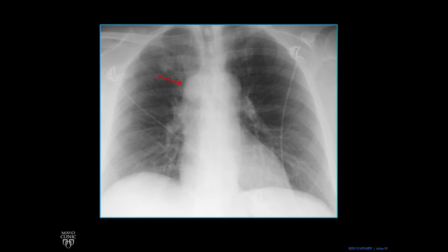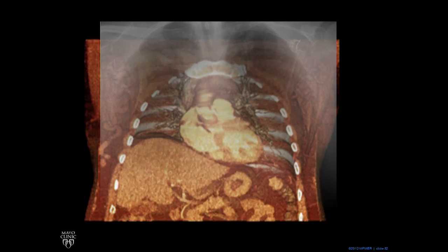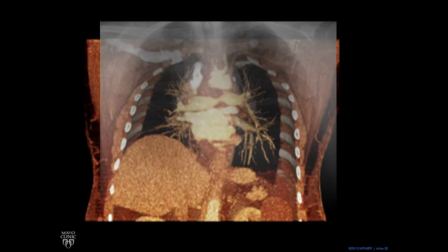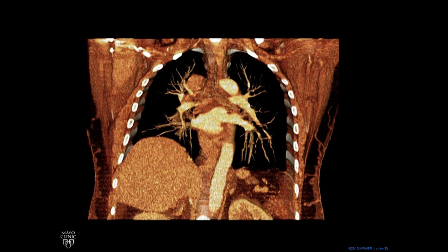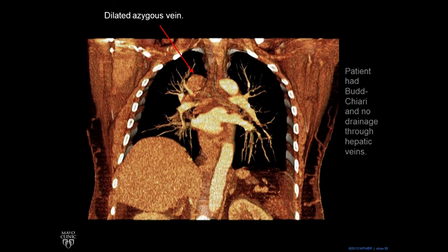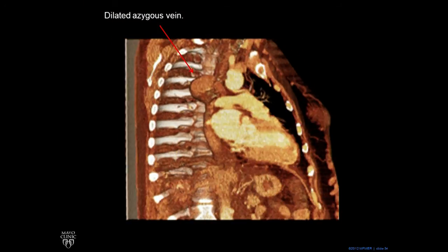Normally, in most cases, that would probably be some sort of mass or adenopathy like we had in the previous patient. But we peel back — we have a CT scan, we overlay, we peel back — and we can see that that big round area has contrast material in it. It's a dilated azygous vein. This patient had Budd-Chiari, which caused no drainage to the hepatic veins. Because of that, the drainage to the azygous vein was bigger.